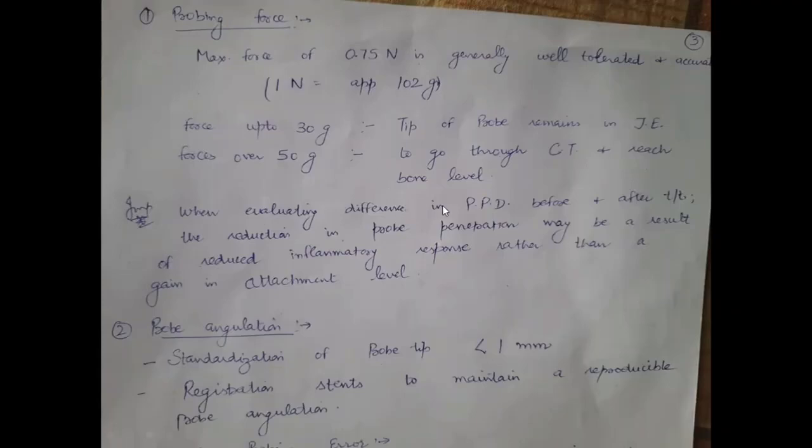Now, when evaluating differences in PPD before and after treatment, the reduction in probing penetration may be a result of reduced inflammatory response rather than a gain in attachment level. This is an important point, I'm going to explain it. It means that when the patient came on the first visit, you noted a probing pocket depth of 7 mm, for example. And after treatment, the probing pocket depth has reduced to 5 mm. Now the question is whether that 2 mm reduction is actually a gain or it is the result of reduced inflammatory response.